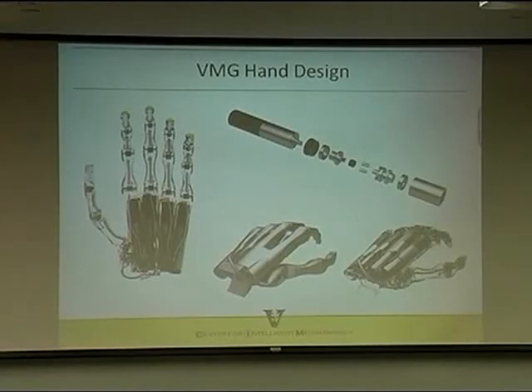What kind of manufacturing is that? Oh, additive manufacturing? It's basically really good rapid prototyping. So rapid prototyping for a long time was prototyping. But now the strength of materials and the resolution and the costs are such that people have started calling it additive manufacturing. Instead of subtractive, like what you normally do using drills and mills and lathes and whatever. Instead of taking material away, you build up the material from nothing.